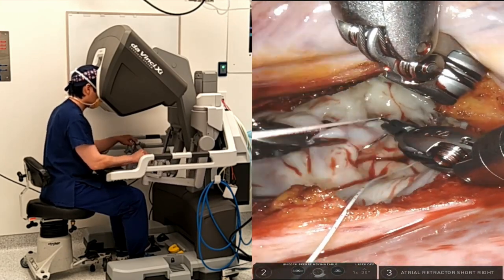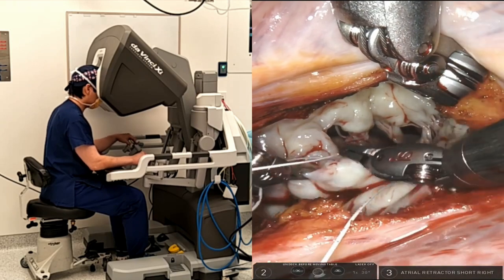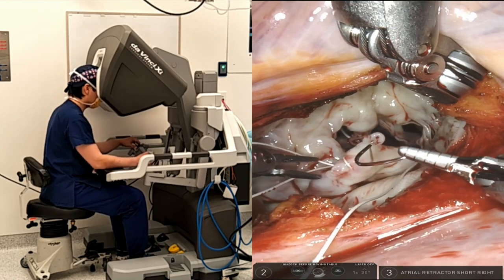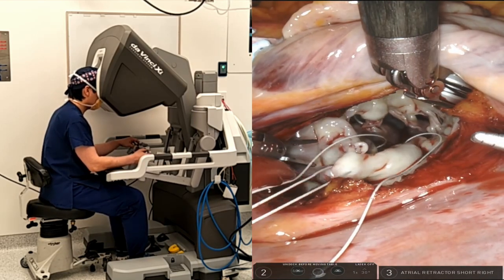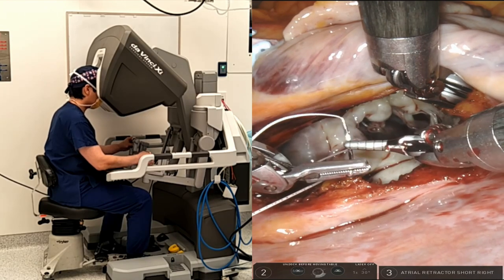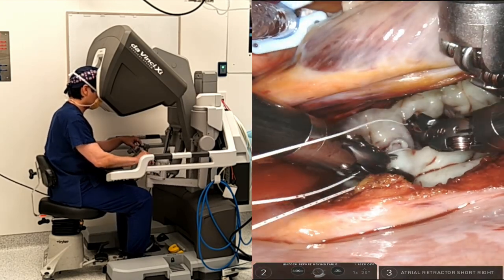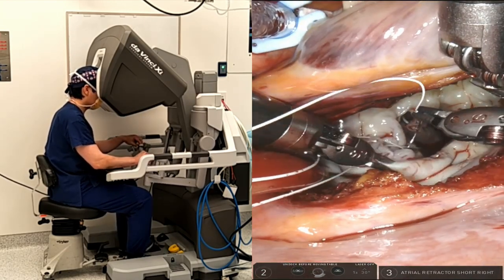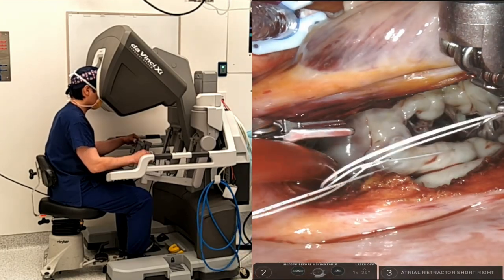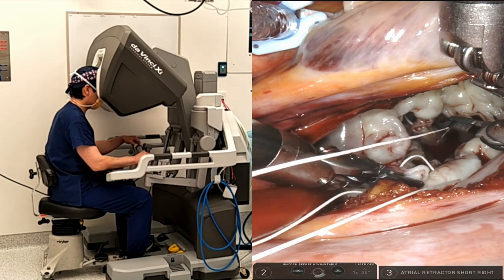Just make sure you get good purchase of tissue so the suture won't cut through. Now pick up the other needle and also pass through the free edge in the same fashion. Often I choose to use two sets of cords to reinforce the P2 segment, but in this case I only used one set because the ruptured cordy were on the P1 side of the P2 segment.